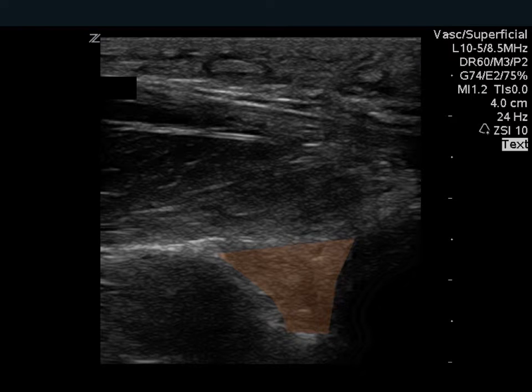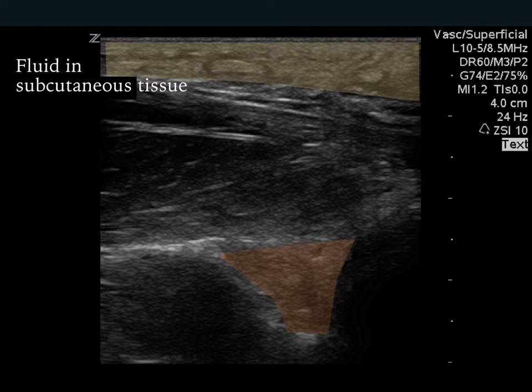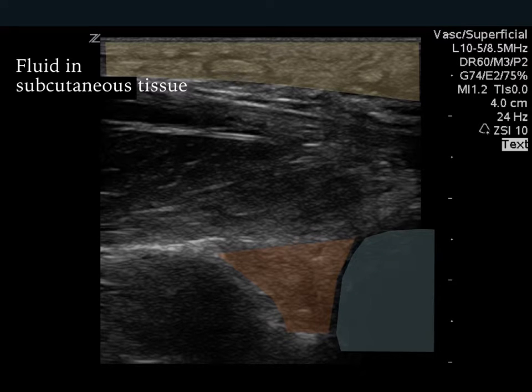Can you identify the subcutaneous tissue? Does it look normal? There seems to be extra fluid within the subcutaneous tissue, which is in keeping with the cellulitis this patient has. While the patient does need antibiotics and follow-up, at this point they do not warrant an aspiration of the elbow joint. Of note, too, is the shadow that we are seeing in the right lower corner of the screen. It is the trochlea and its shadow. So that is the basics of assessing the elbow joint for an effusion, which is an indirect finding of pathology.